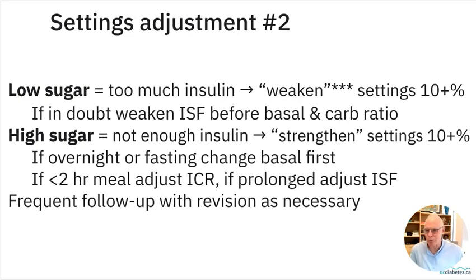If the sugar's high, we haven't got enough insulin, we're going to strengthen the settings by 10% at a time or more.